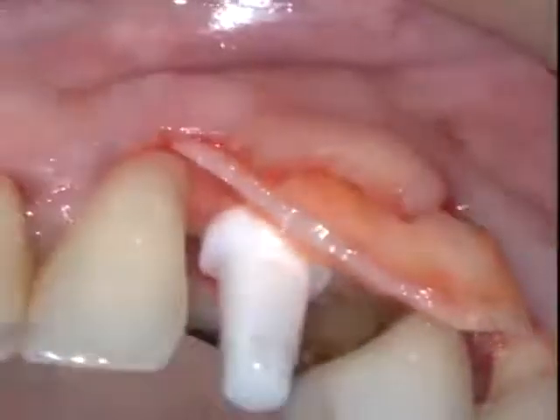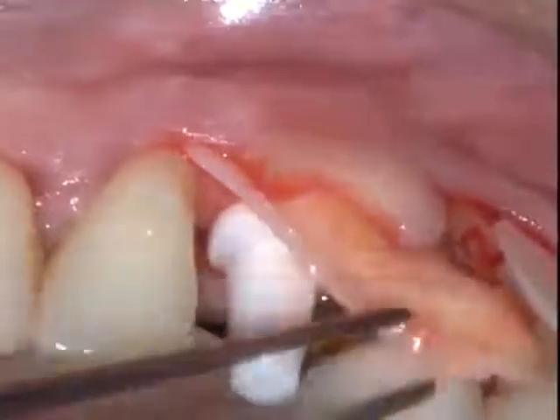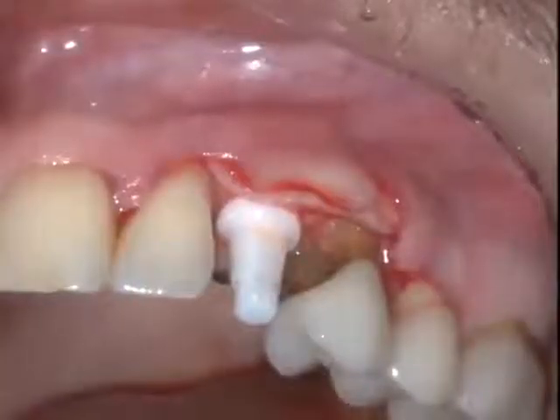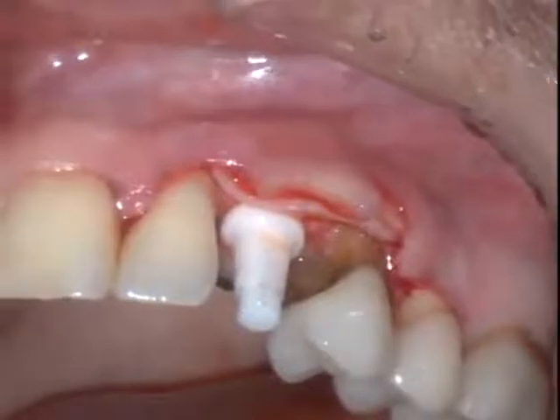This is a one-piece implant, so the abutment and the implant body are connected as one piece. And then we're going to locate the connective tissue graft to enhance the thickness of the tissue on both the implant site and the adjacent natural teeth.